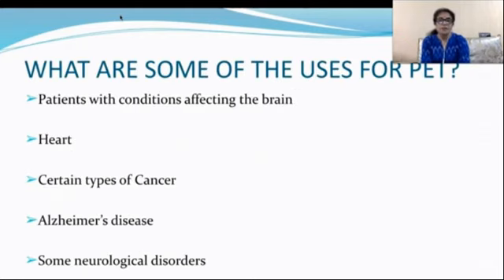What are some of the uses for PET? Patients with conditions affecting the brain, heart, certain types of cancer, Alzheimer's disease, and some neurological disorders.